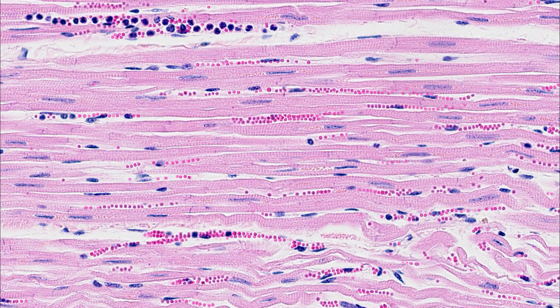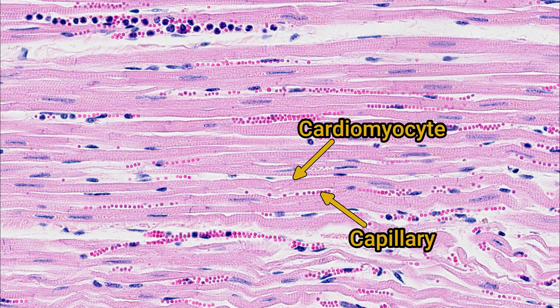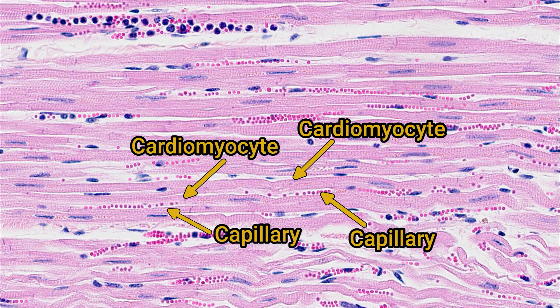Another notable feature of cardiac muscle is its rich vascularity — there are loads of capillaries. You'll often see them alternating with cardiomyocytes: one cardiomyocyte followed by a capillary, then another cardiomyocyte, then another capillary, and so on. This close contact with blood vessels ensures that the muscle cells receive the oxygen they need to maintain repeated contractions and keep blood pumping around the body.